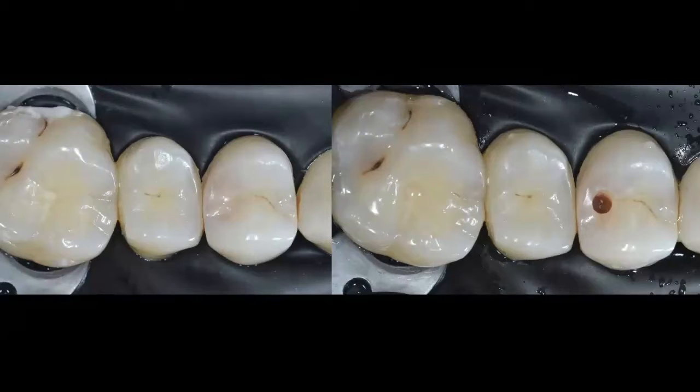We try to prevent any burr from touching the proximal wall of the neighboring tooth. This is critical because we would like to maintain the proximal wall anatomy of the neighboring tooth intact, so that we can obviously restore our proximal wall following the natural contours of teeth.